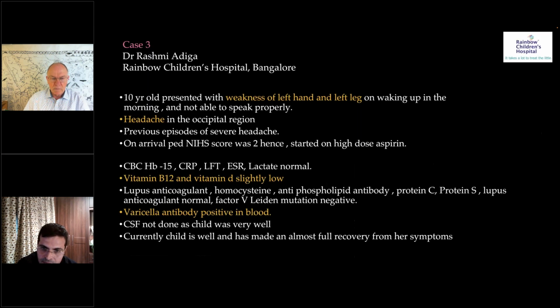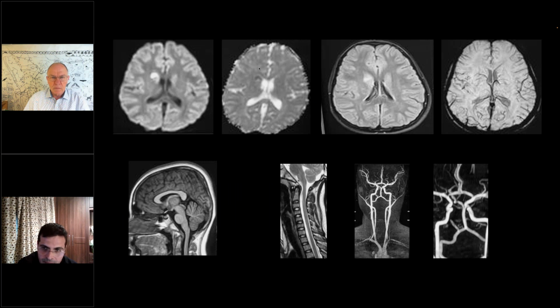But at 10 years, it could be slightly unusual. They usually present in the toddler age group, but anyway. Without the CT, I cannot rule out mineralization, but I thought mineralizing is in younger kids, no? When they have a small trauma. Yeah, trivial trauma, usually. I don't know about the age range. I think Lokesh, it was 10, yeah. Usually in infants up to 2 to 3 years, they say.